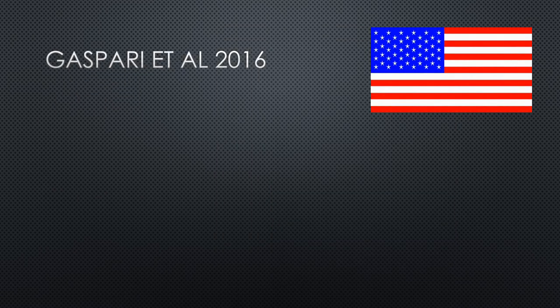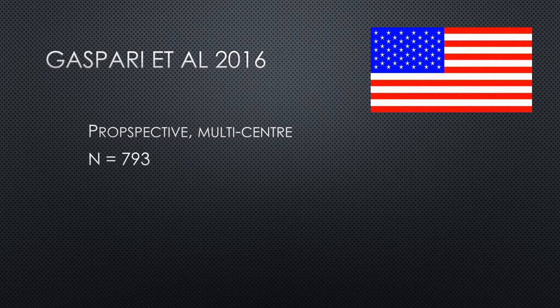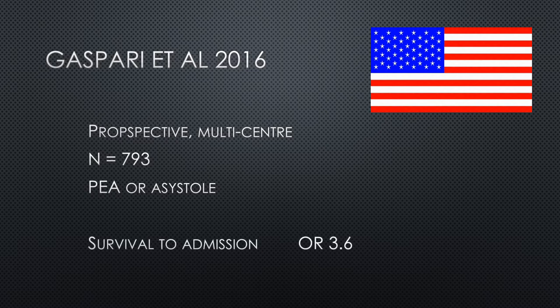So today we'll be focusing on non-traumatic, non-shockable arrests, so PEA and asystole. And there was a large paper published on this topic in 2016 by Gaspari et al. It was a prospective multi-center trial that looked at nearly 800 patients, so it's by far the biggest trial on this topic. And so they looked at adults with non-traumatic arrest who were in PEA or asystole, and their primary outcome was survival to admission.